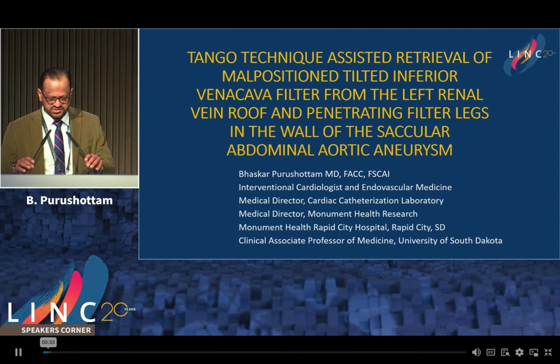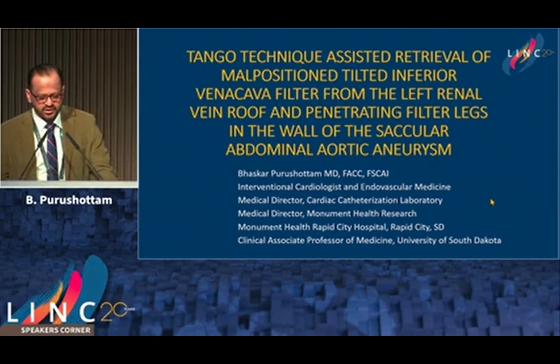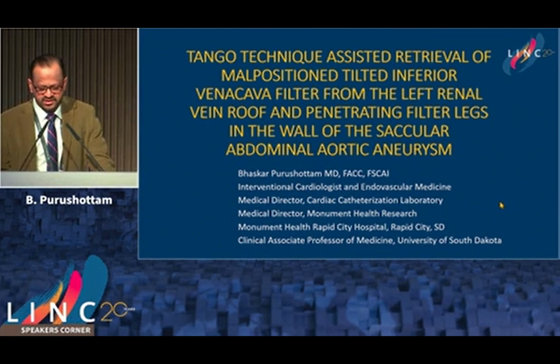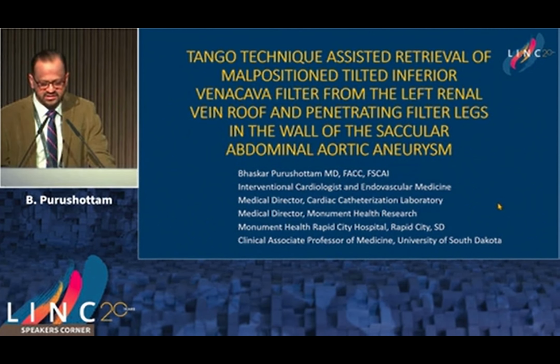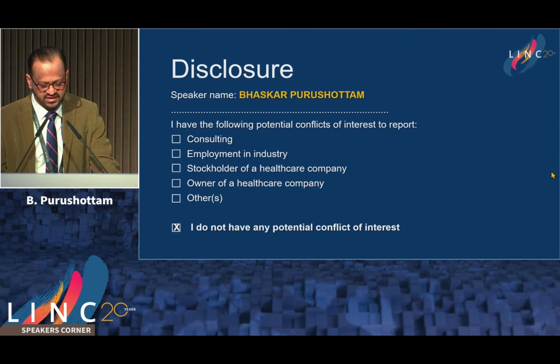Thanks for the invitation. What I'm going to show is a patient with a malpositioned, tilted IVC filter with penetration to the roof of the left renal vein and the saccular aneurysm, and how I used this tango technique to successfully retrieve it.